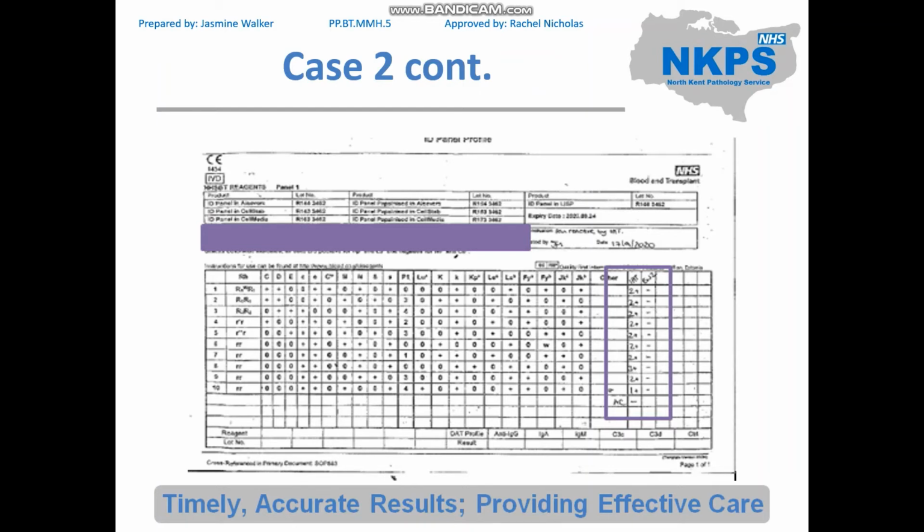However, this patient also has the anti-little c. So having a look at this, you can probably make that guess or that informed decision that the patient's anti-little c is not currently circulating. However, this still means that any of the other antibodies that are destroyed in enzymes, so from the MNS system or the Duffy system, etc., could still be there and being masked by these two antibodies.